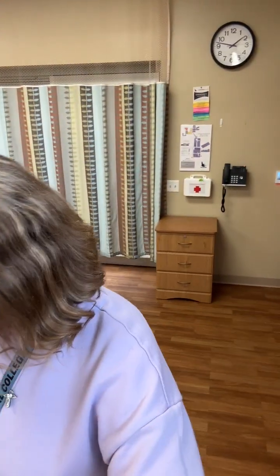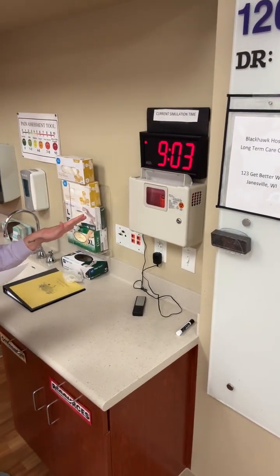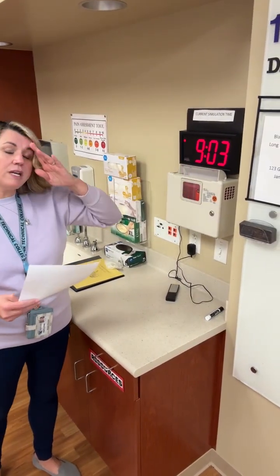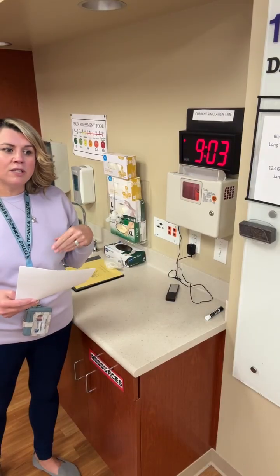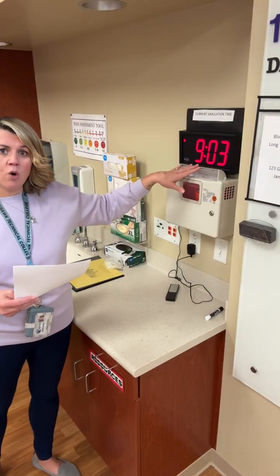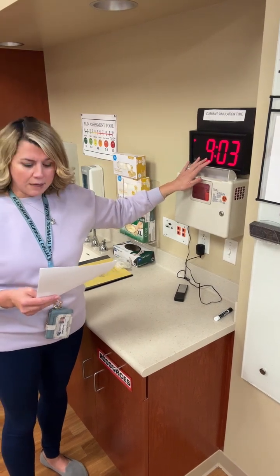Let's start over here, right here, Ash. Okay. All right, so we're going to talk about this area here. This is your sim time. So it's backwards for you right now. It says 9:03. But if you're wanting to know what time your simulation stage is at, like if you're on first shift or second shift or whatever time you're at, this is what you're going to go off of. We have a clock in the room that's also for regular time, but this is what you're going to pay attention to for sim time.